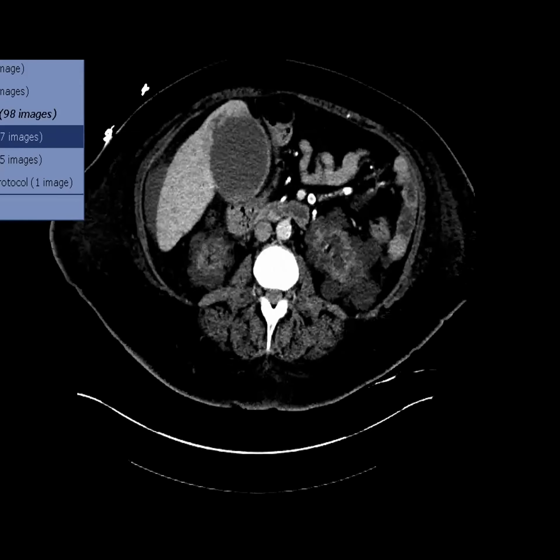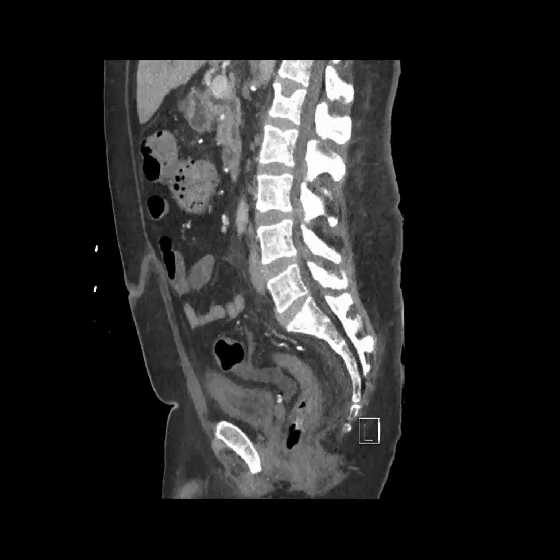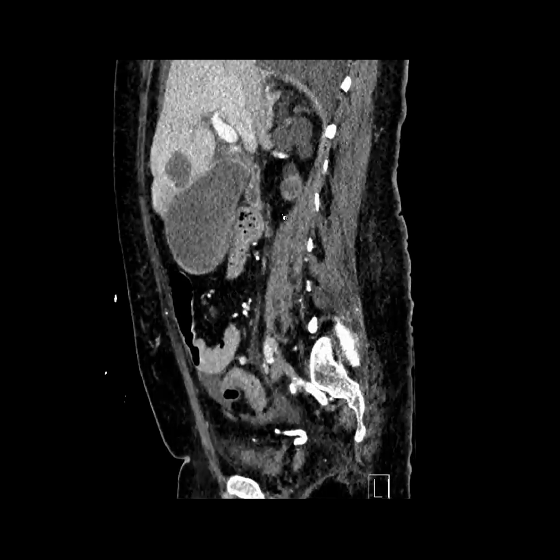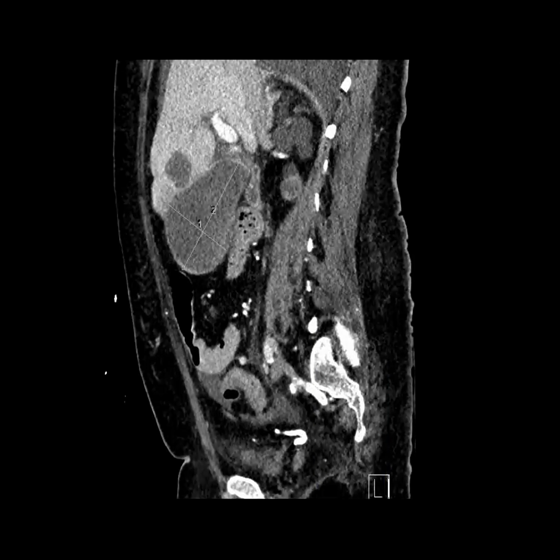The other thing that Aya talked about was that the length of the gallbladder can be even more specific than the luminal distension. So she said in luminal distension, we talk about 4 centimeters. I think this was like 7. But then the length, she said, if it's greater than 8 centimeters, that's even more specific for acute cholecystitis than the luminal distension.